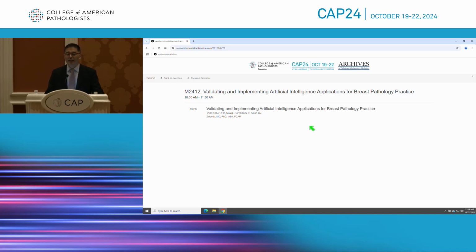We are having some challenges because we are using Philips IMS. It's a kind of closed system. It's not easy to integrate third-party tools there. So we use the streaming function to stream those digital images into another platform, as I showed you here. It's still pretty fast, but it's an added step.